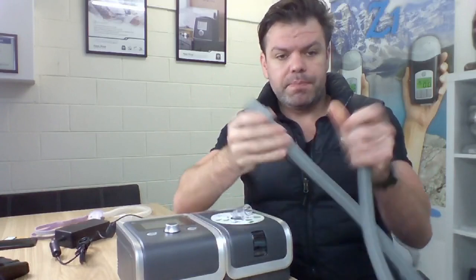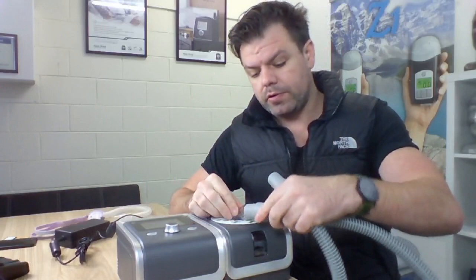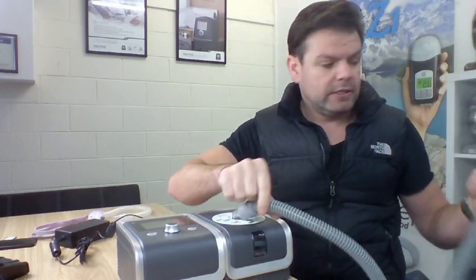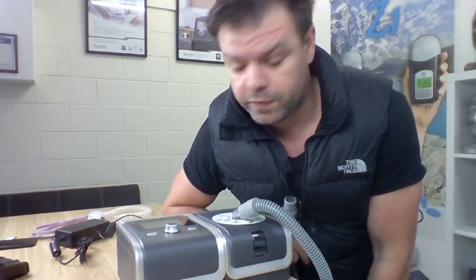So what we're going to do here, both ends are exactly the same, all right, and we're just going to put one end onto the machine, onto the humidifier here. This is the end that swivels around, okay, which is handy. And then the other end is going to go onto our mask, which I'll put on in a minute, just to show you how that works.